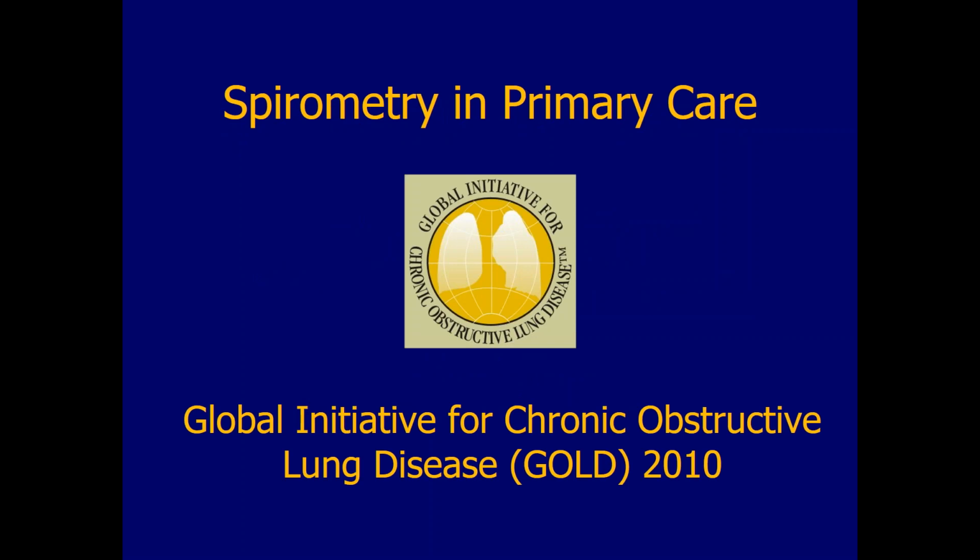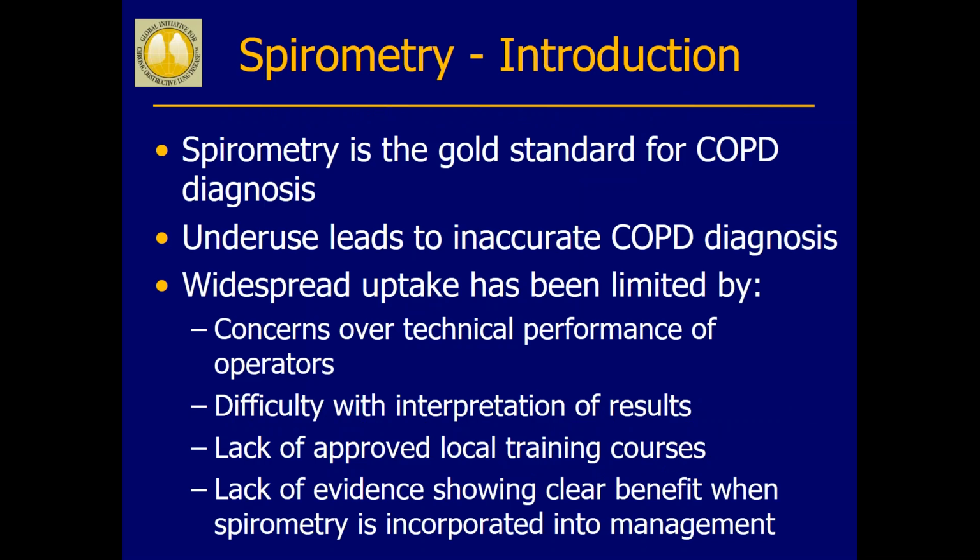So for this presentation, we took a lot of the information from the Global Initiative for Chronic Obstructive Lung Disease, or GOLD. The GOLD Initiative has updates. We're using the slide set from 2010 because they haven't made new slide sets since then, but the information is valid and concurrent with the 2018 updated guidelines. So spirometry, this introduction, it's the gold standard for COPD diagnosis.